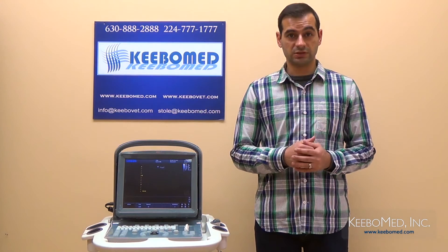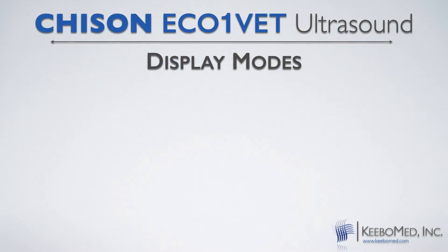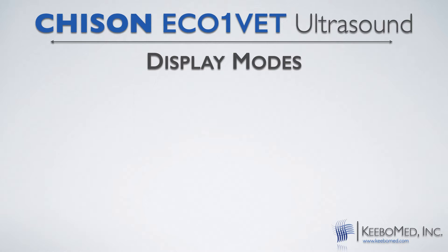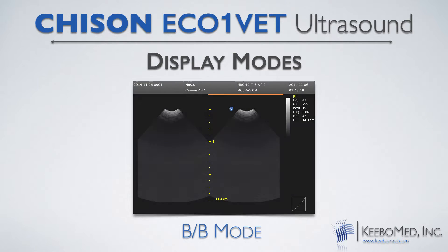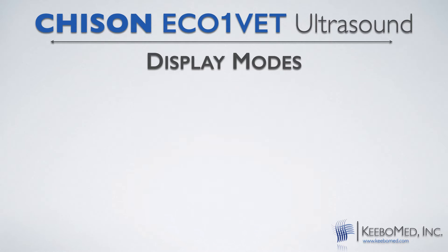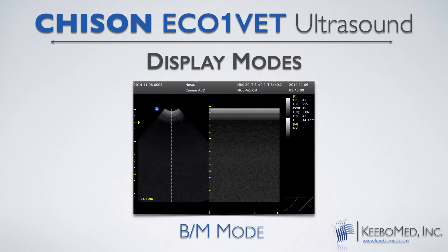There are five different display modes that are available depending on your needs. They are B, BB, 4B, M, and BM.